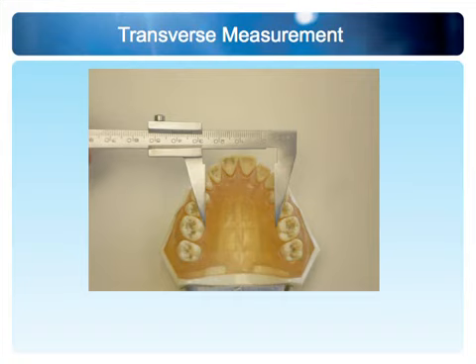Otherwise, these prongs are usually long enough, and the arms will extend right into the mouth. You can slide the gauge open and make the measurement between the two molars and just record it. Then you have an idea of what the patient's width is. Somewhere around 35? Is it 33 or is it something like 28, 29, 30? And that's a great way to start, establishing where in the mix of my information is arch width.